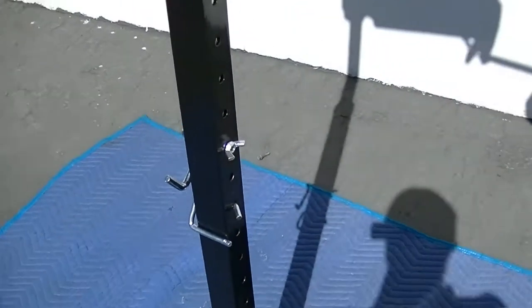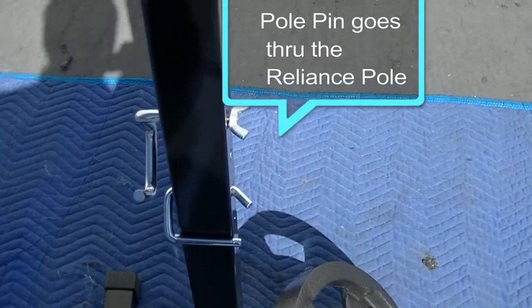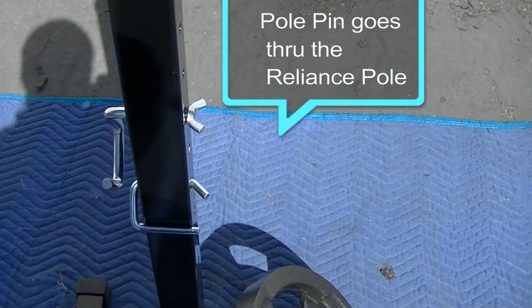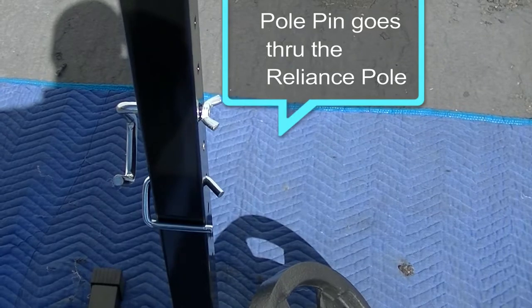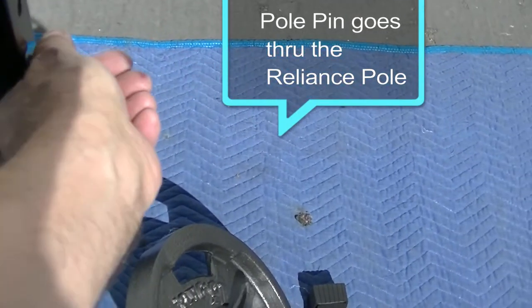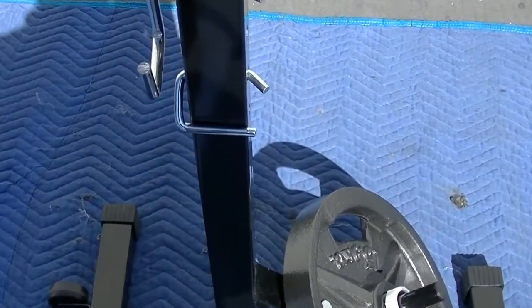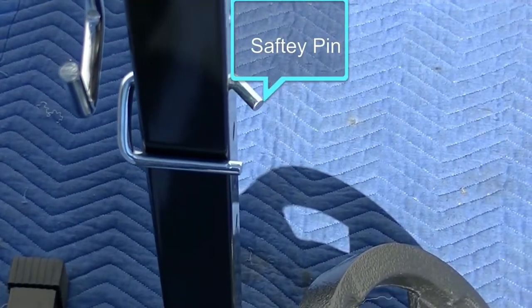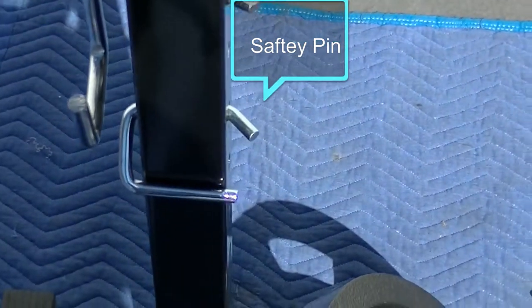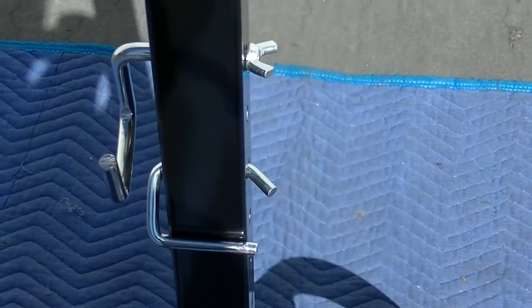Here we have the pin that holds the support in place through a hole that's in the pole. It goes through the entire pole and tightens down with a wing nut. The one below it is a safety pin so that if you drop the main pin out, it goes down and hits the other pin for safety so the pole doesn't come crashing down.